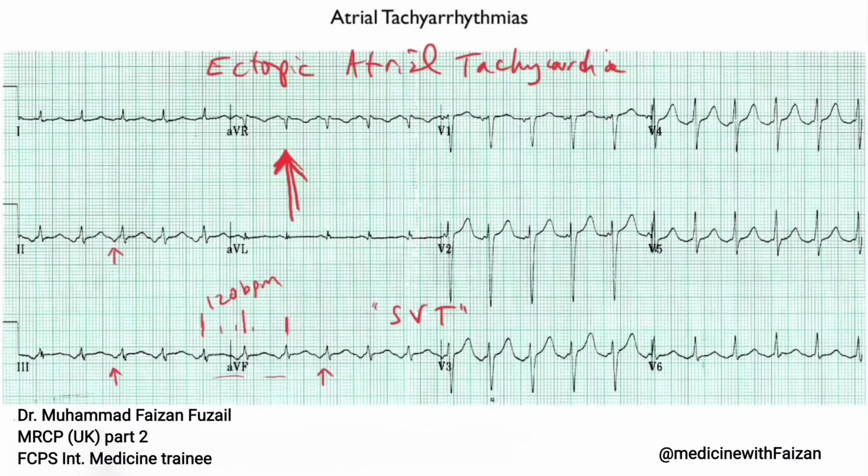I want you to be able to recognize this kind of supraventricular tachycardia as being a regular narrow QRS complex, with a P wave, generally one-to-one association between the P and the QRS with a fixed PR interval. And you'll sometimes have to actually give the patient medications to end it. Now this kind of sudden onset rapid regular rhythm is often referred to as paroxysmal supraventricular tachycardia, or PSVT, and PSVT is generally considered to be due to short circuits, often involving the AV node.